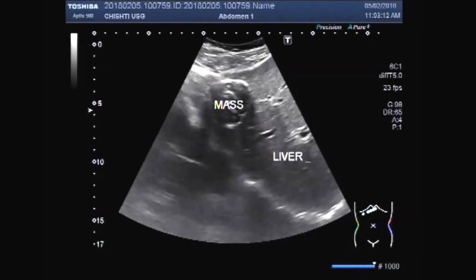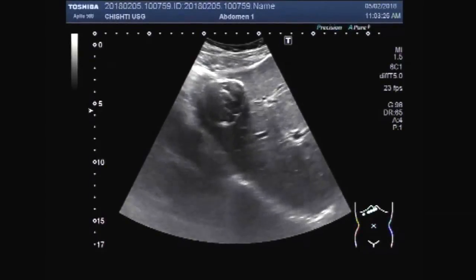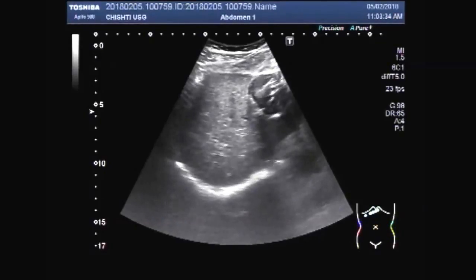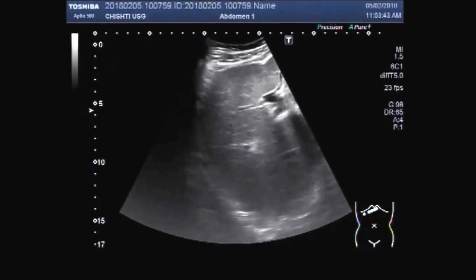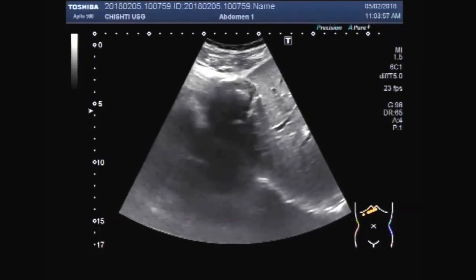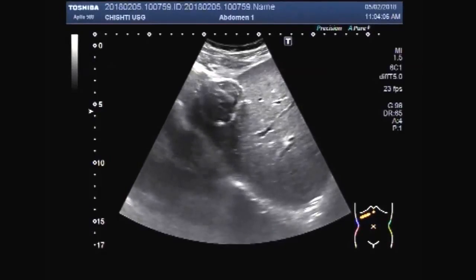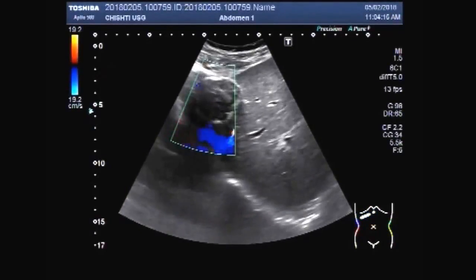This is the mass, this is the liver, and this is the heart — just a little bit visible. No blood flow is seen in the mass.